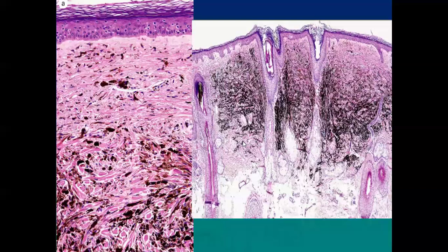If you find a blue dot, a papule or a macule, then the diagnosis again is quite straightforward. It's a blue nevus, and histology will show very heavily pigmented melanocytes which are present in the dermis. The melanocytes are mainly of ribbon-like pattern in the blue nevus, and rarely they are in the form of globules.